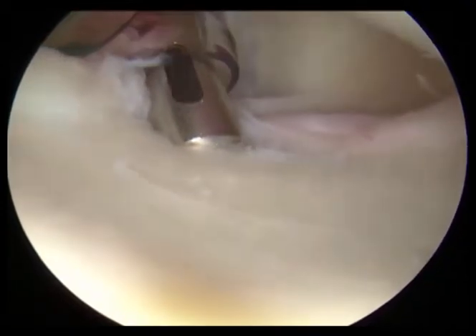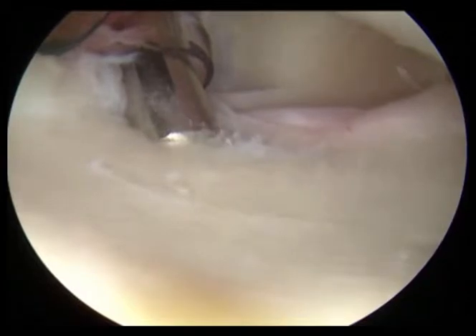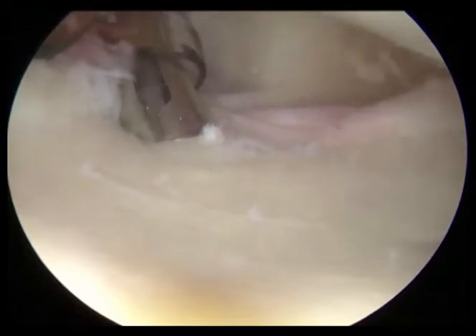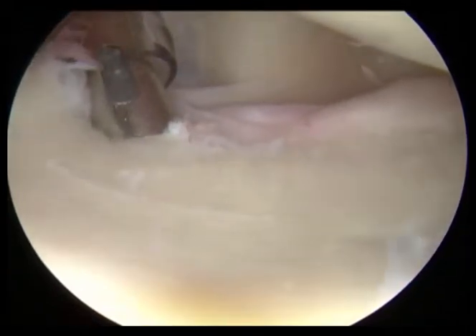We're not injuring any part of the joint. You can see we're drilling a hole here, and then we're going to place an anchor. That anchor has an eyelet with several really strong, powerful sutures that we're then able to pass through the labrum.